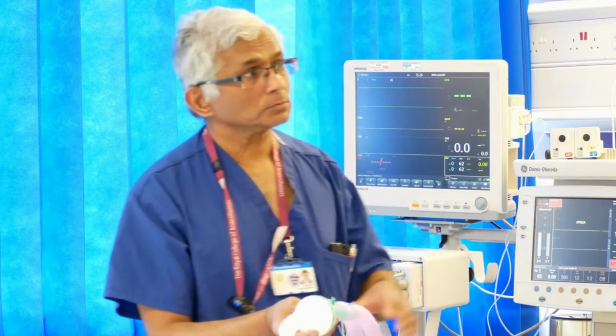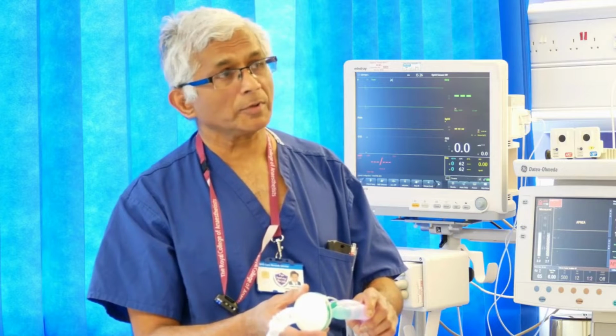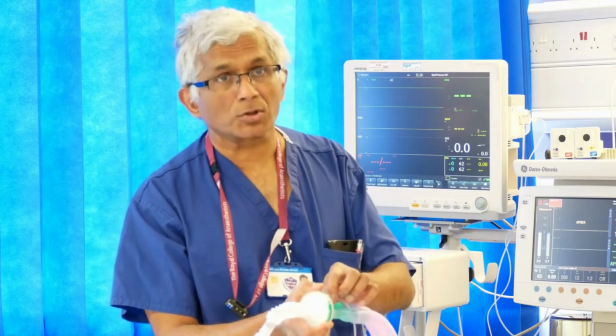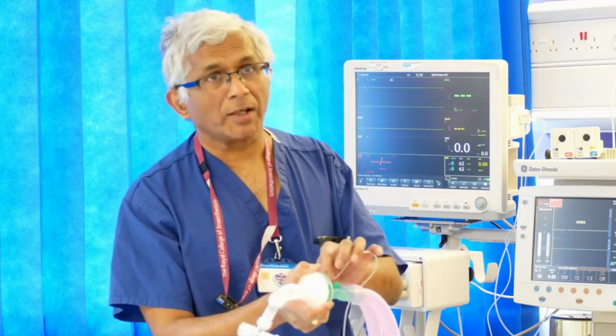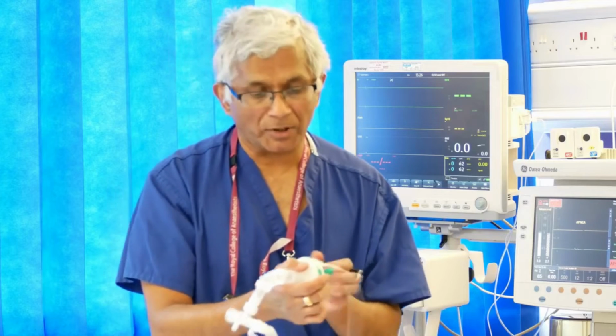Obviously, that's something which we would expect the ICU trained nurses and doctors to do. We will not be expected to do that. So I will show you the tracing, which is important to understand. We call it end-tidal carbon dioxide tracing.